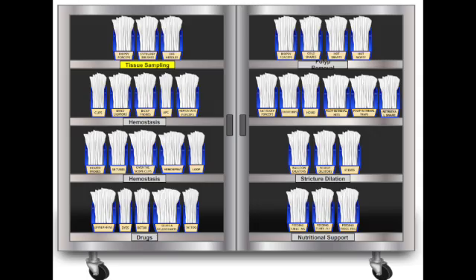Okay. And the hot snare. Hot snare uses electrosurgery. You loop the polyp, apply current as you close the snare. The heat cuts and cauterizes simultaneously. For bigger polyps. Yes, generally for polyps larger than 10 millimeters or for pedunculated polyps, ones on stalks. Also essential for EMR techniques we discussed earlier, often used after lifting the tissue with injection or banding. And snares, both hot and cold sometimes, are great for grabbing and retrieving foreign bodies or dislodged stents.